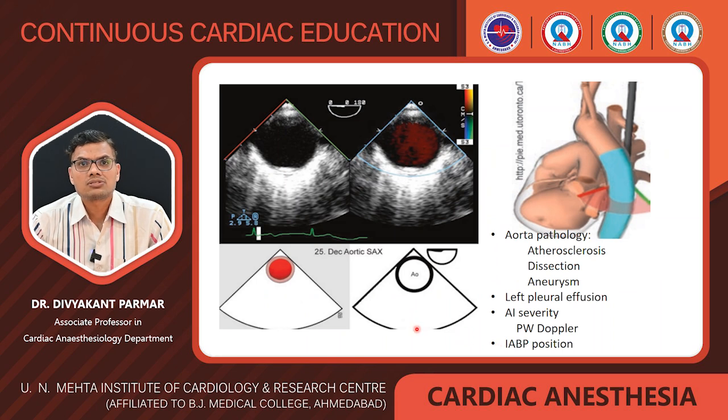And we can also assess the entire descending aorta by advancing or withdrawing the probe, keeping the aorta in the center. So we can also detect any atherosclerosis in the wall of the aorta, any dissection flap present or not, and aneurysm of the aorta can be diagnosed.